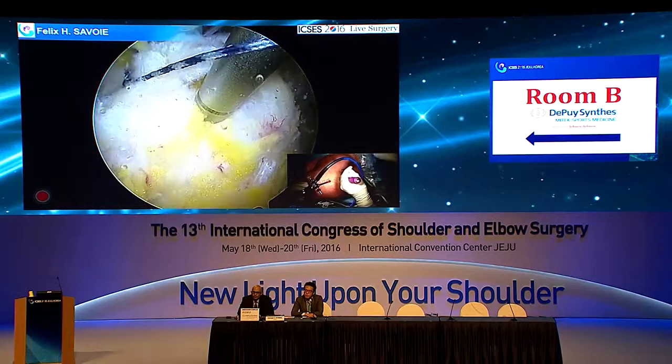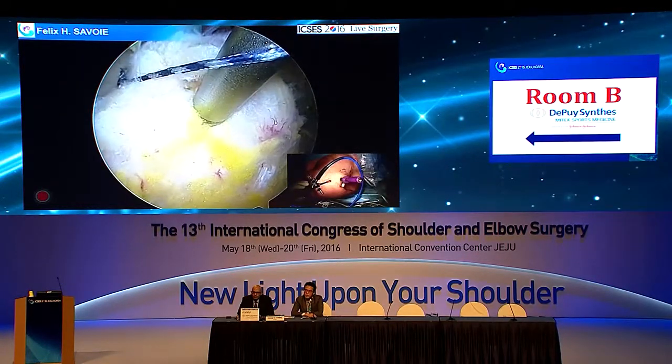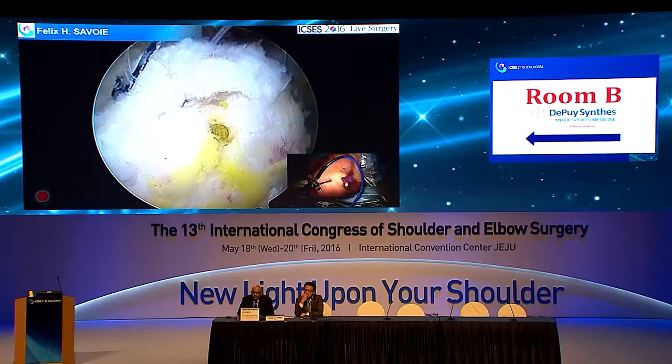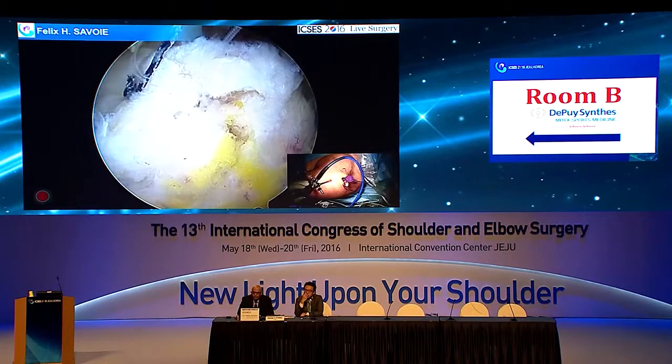See the fat bubbles coming out where we made the trephination holes? Isn't that good? So that's our stem cells coming out to help it heal. So then we know where our hole is. And so we'll take our footprint and we'll feed all these stitches through there.